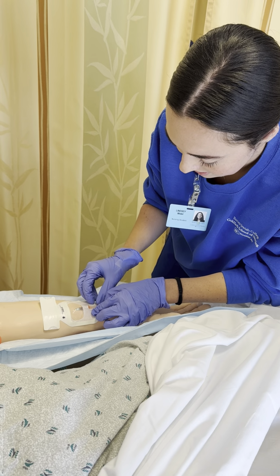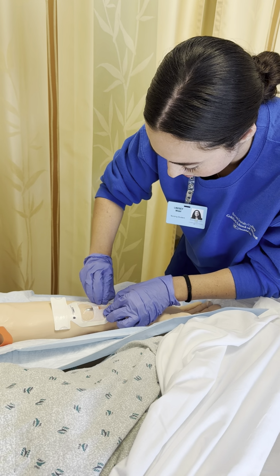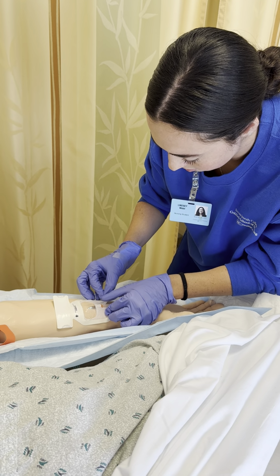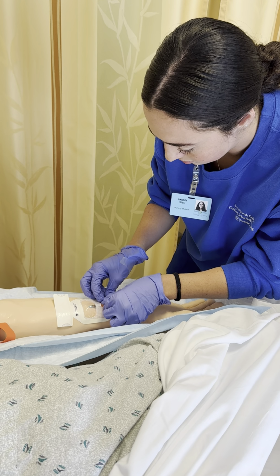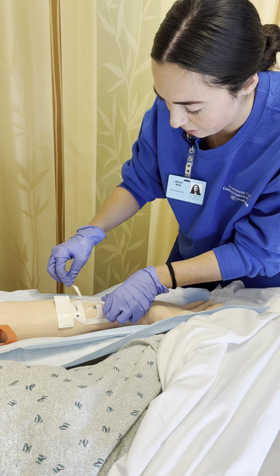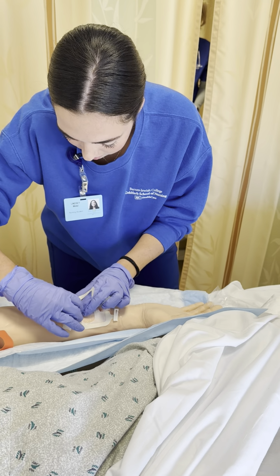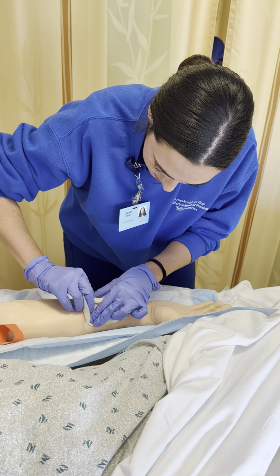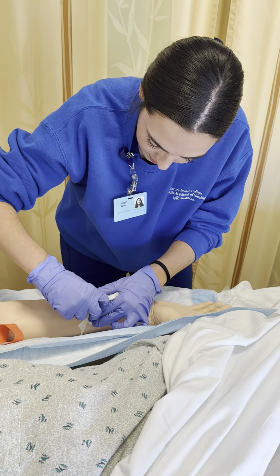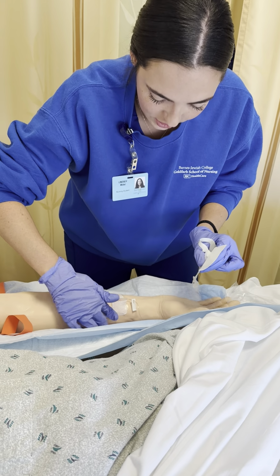And then we're gonna peel this tape up here off. Okay, I'm gonna make sure to seal it down around the edges. Okay, there we go. Looks good.